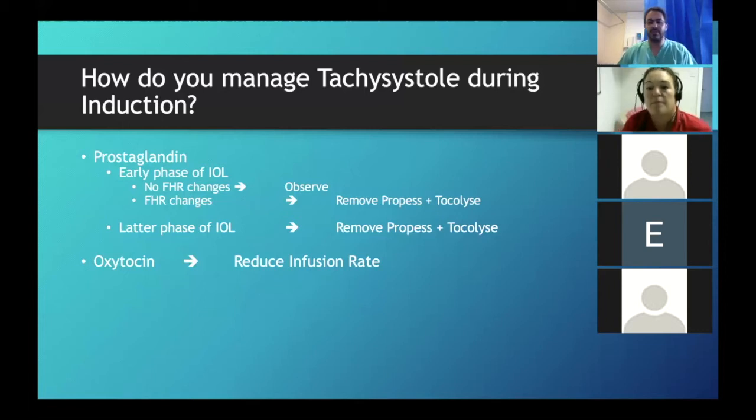So if there is a rise in baseline with no decelerations to precede that, that is most likely sepsis or temperature until proven otherwise. That's not hypoxia. Okay, we need to look outside why this is happening. I mean, if it's chronic hypoxia, that this baby's not responding at all, that can be another reason.